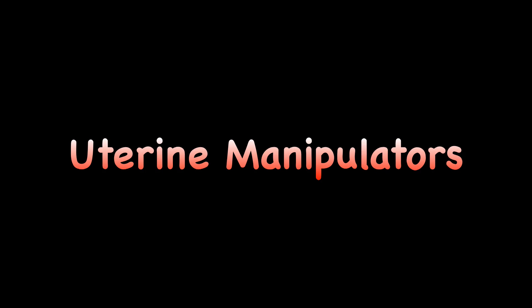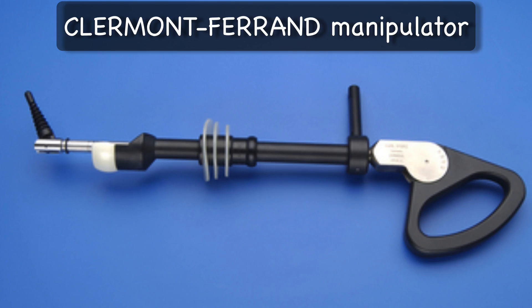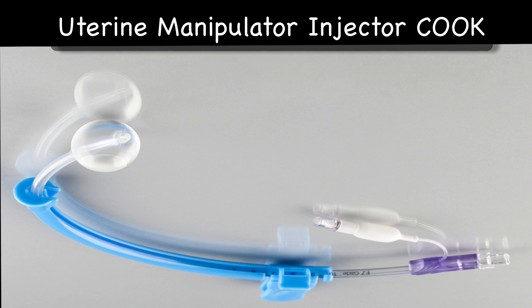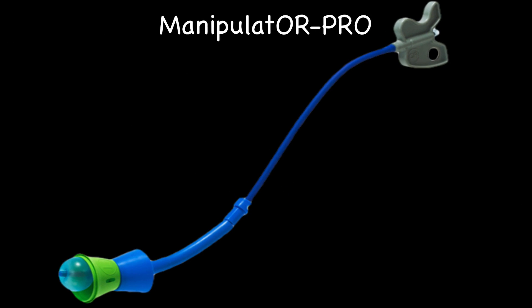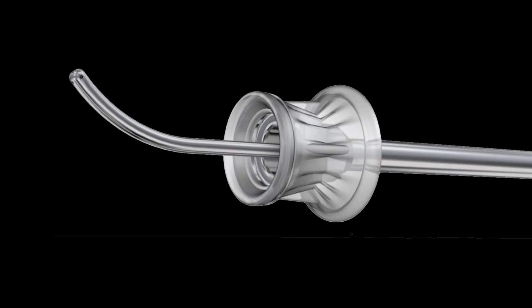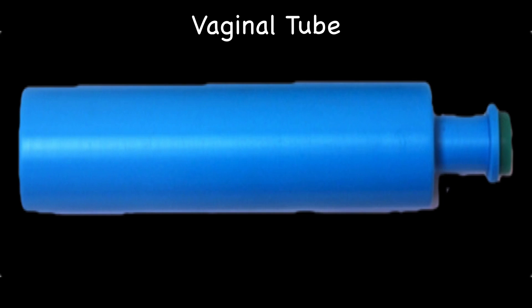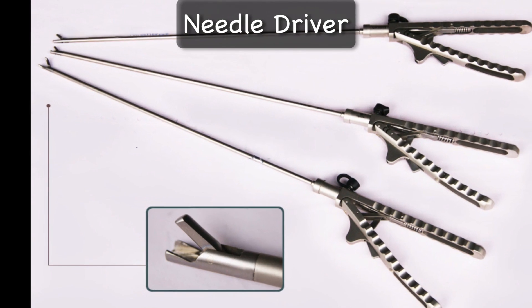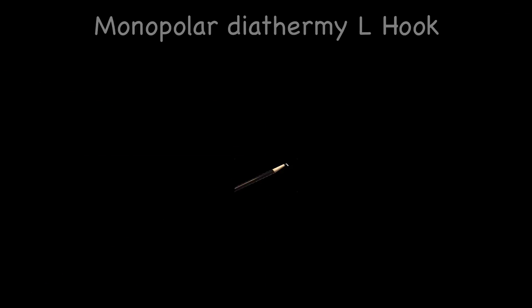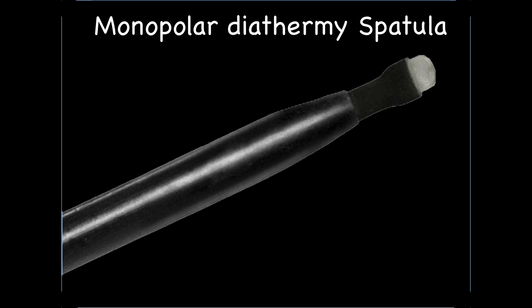Now I will show different types of uterine manipulators. Clermont-Ferrand manipulator. Cook uterine manipulator and injector. ManipulatOR-PRO. Secufix uterine manipulator. Plastic vaginal tube. Endoscopic needle driver. Monopolar diathermy L-hook. Monopolar diathermy spatula.